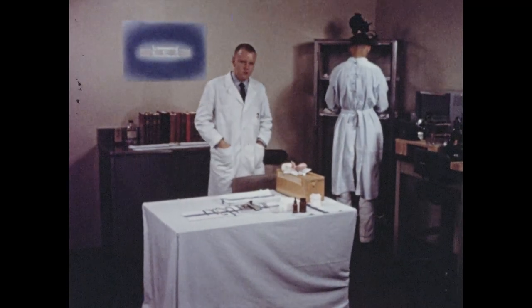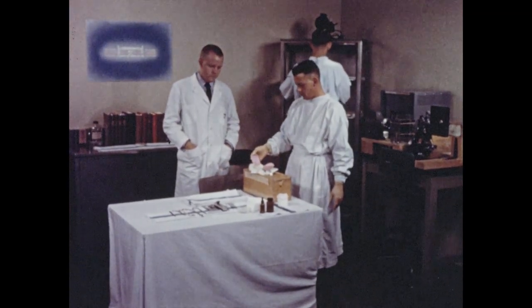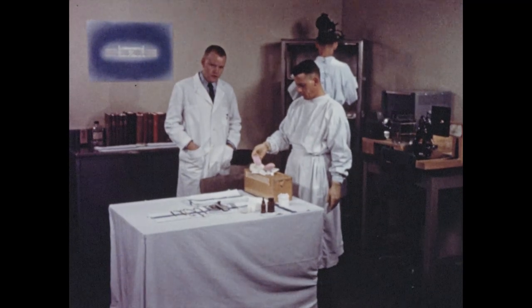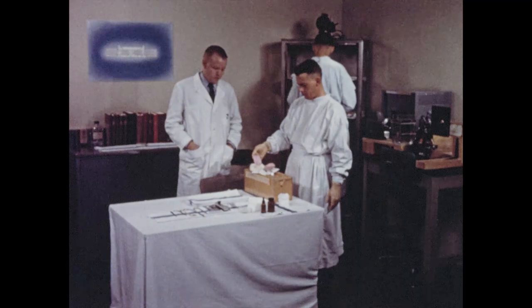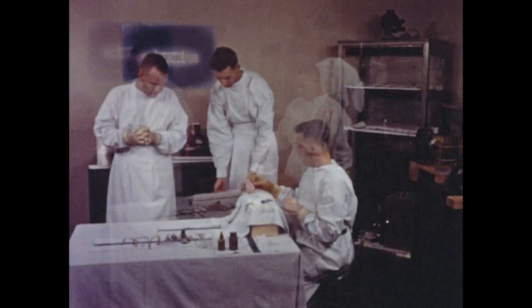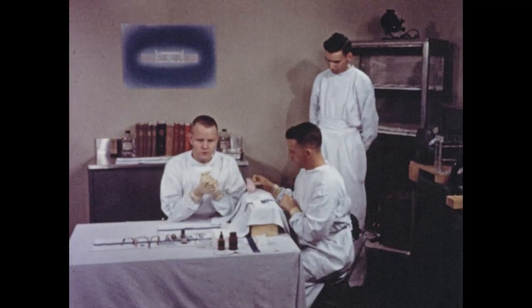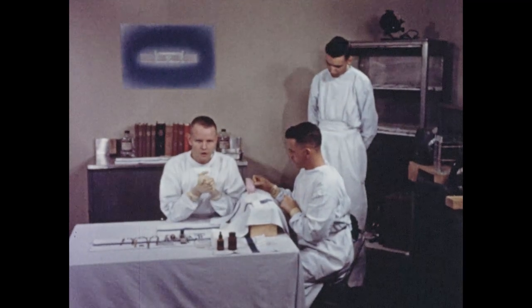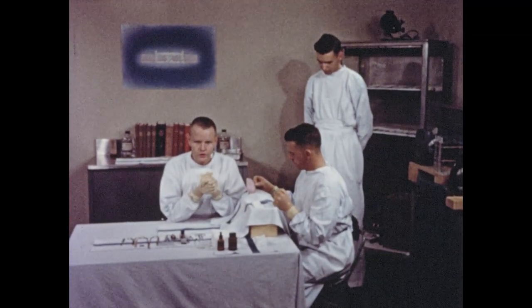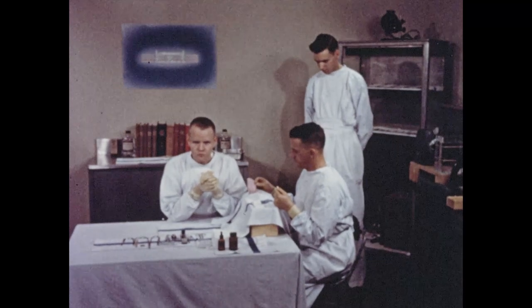This rabbit has been prepared for surgery. He has received the injection of long-acting penicillin, a tranquilizing drug, and intravenous anesthetic agents. The ear has been prepared by the complete removal of the hair by the use of a common cosmetic depilatory agent. Since post-operative infection is one of the major complications of the ear chamber technique, we have used all possible precautions to minimize bacterial contamination before, during, and after surgery. These include the use of an aseptic surgical technique and preoperative treatment with penicillin.